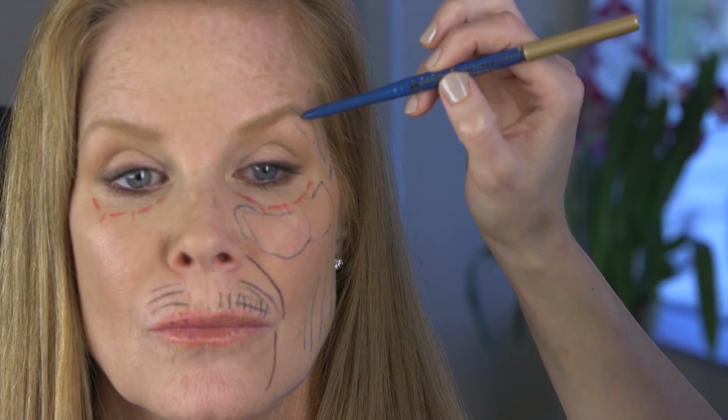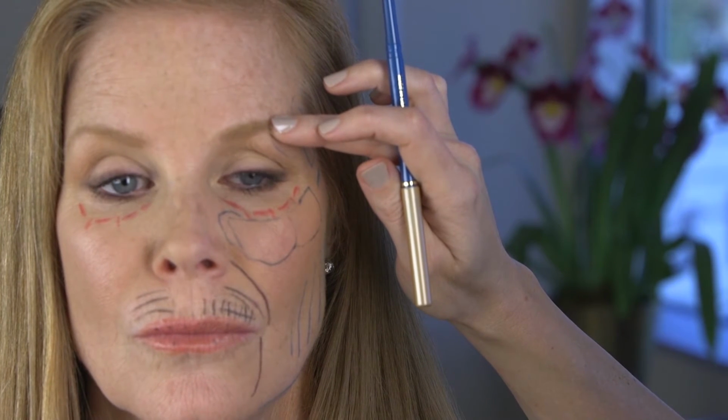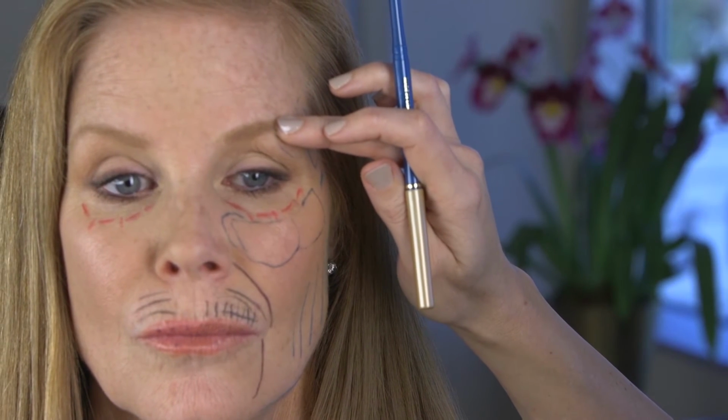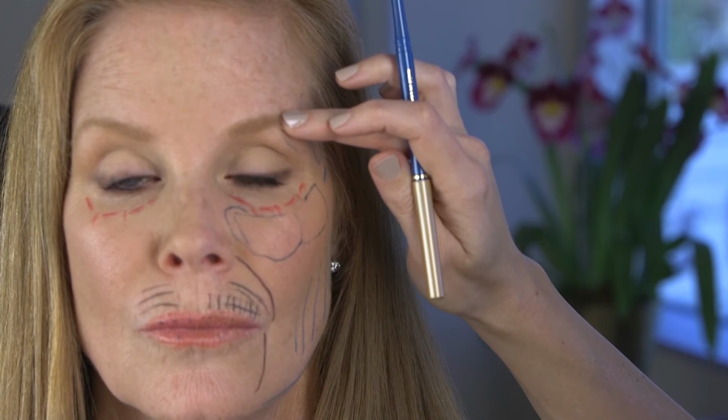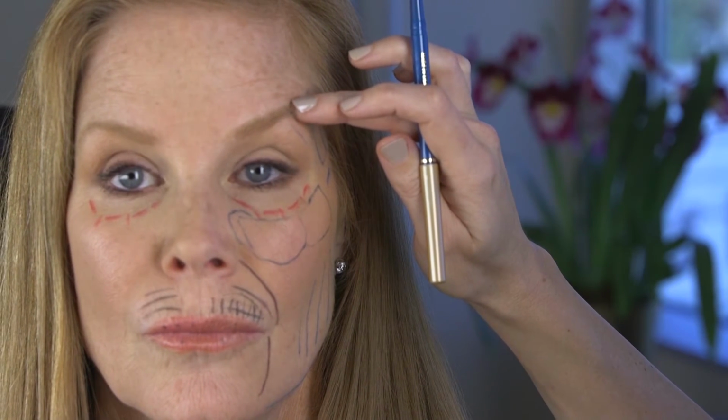And with Jana, there are certain areas where you can use products that she doesn't need. There's a fat pad that actually lives in this brow. So sometimes people who feel like their brows are falling down and are not interested in having surgery, there's not a lot of options. You can actually inject hyaluronic acid-based fillers into that fat pad to actually get that to kind of bounce back up.